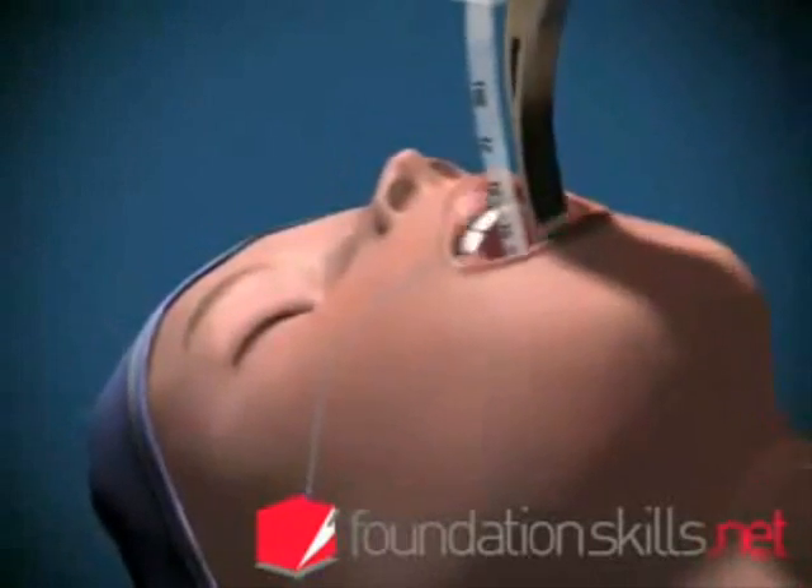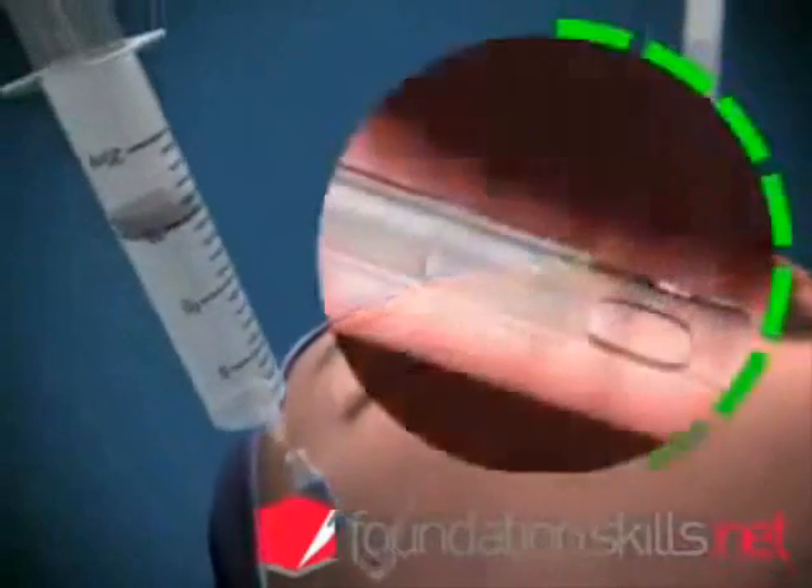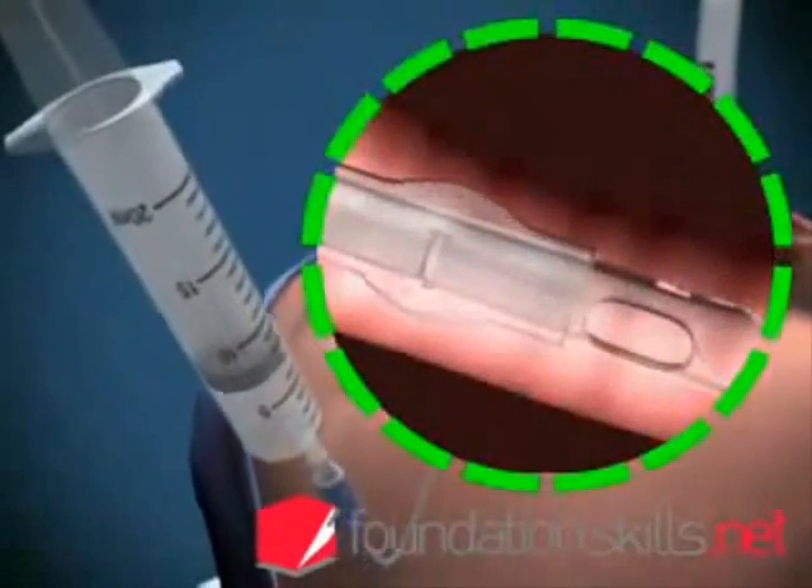Remove the laryngoscope and inflate the cuff with approximately 15 mils of air to prevent air leaking during ventilation.